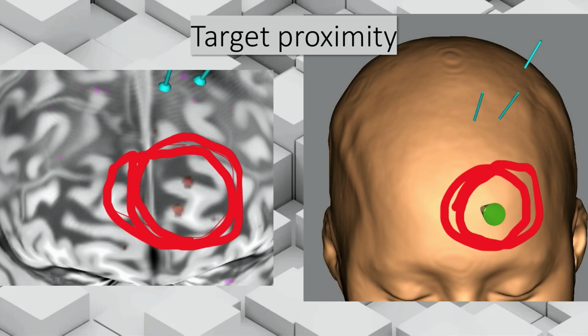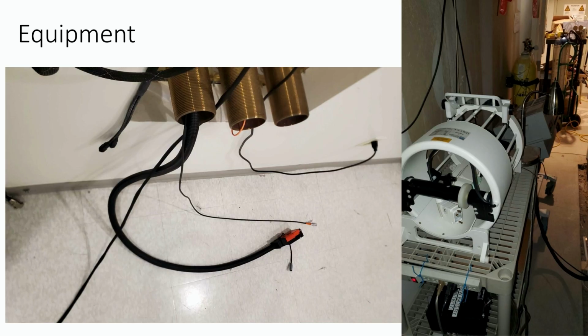I highly recommend it. All right, this is just some of the equipment. Most everything we have is commercial equipment. So having these waveguides and the filters, the panels, this is what it looks like outside of the MRI room and the adjacent room where you're going to have the actual stimulator live. Right, so it goes through there.